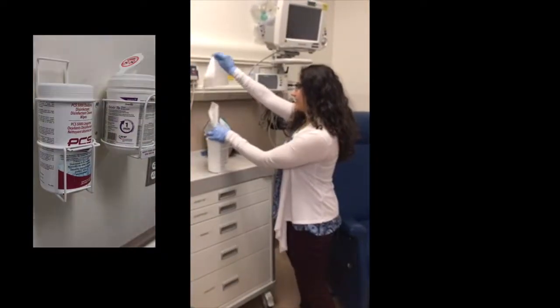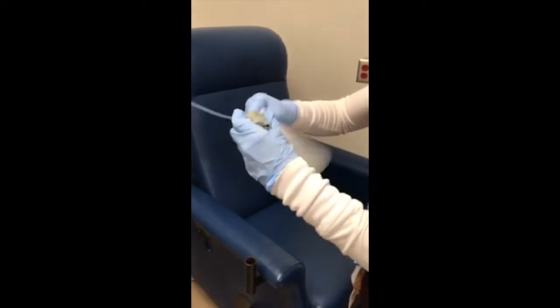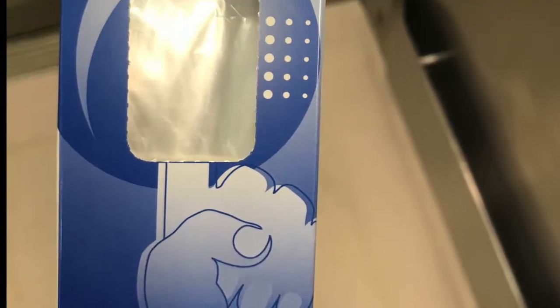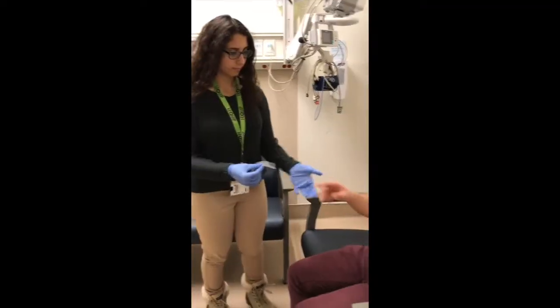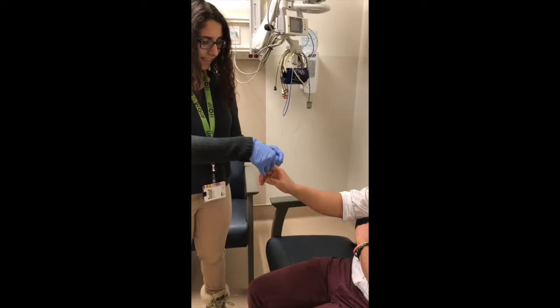Taking a PCS 5000 wipe, be sure to apply rigorous pressure when cleaning both the inside and the outside of the pulse oximeter. When using pulse oximeter finger covers as seen in this video, be sure that the patient performs hand hygiene. Then, taking a finger cover, place it on the patient's finger.